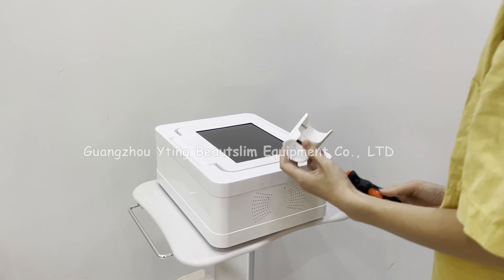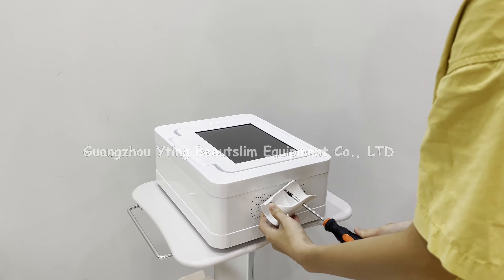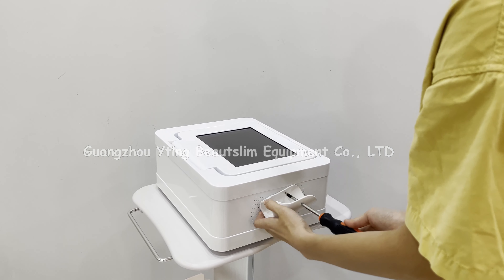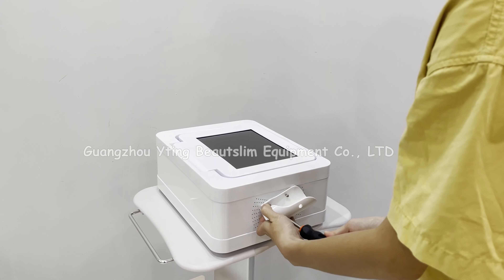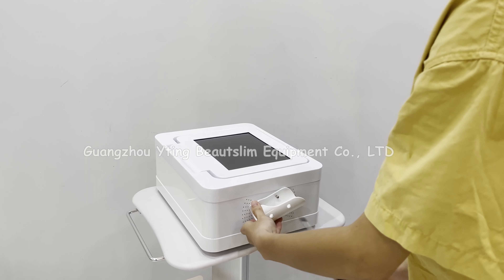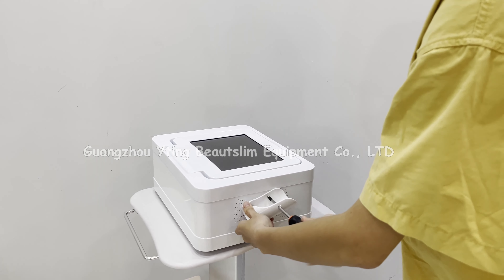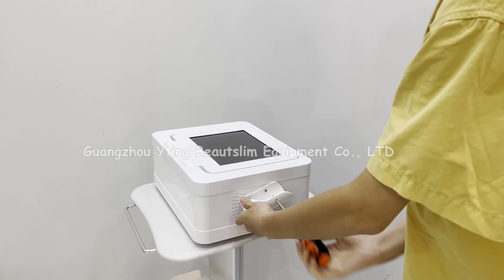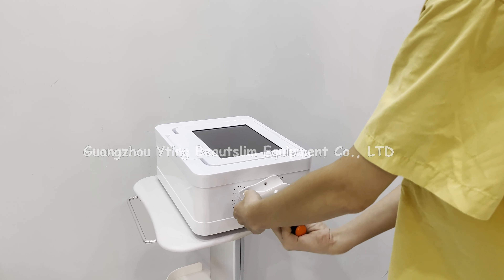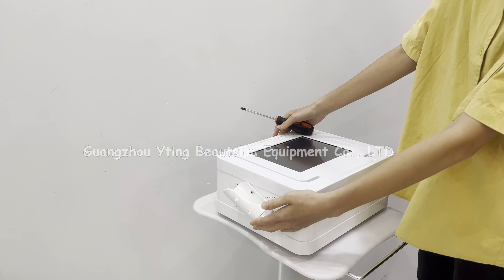Now we install the machine, putting it in the middle of the pan. Connect the other one in the same way.